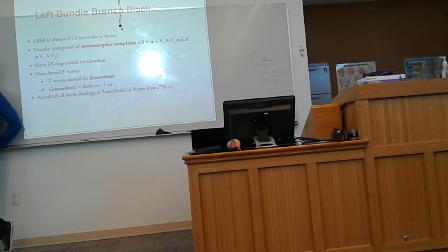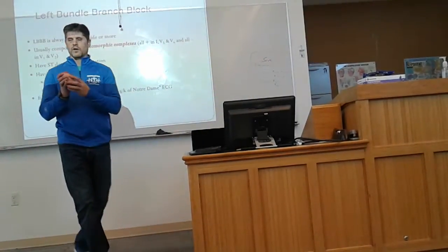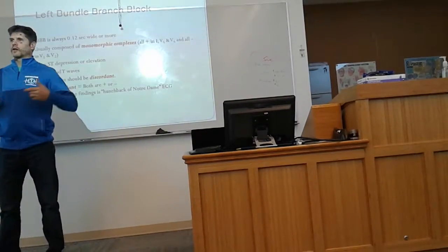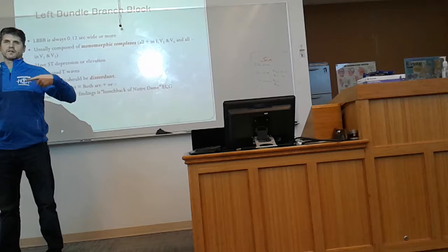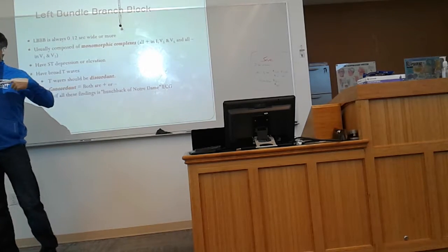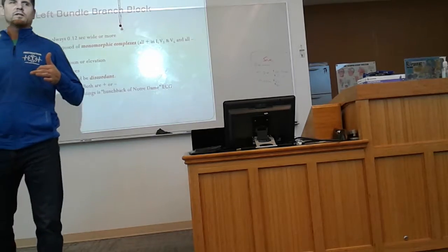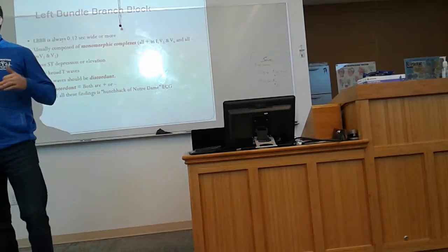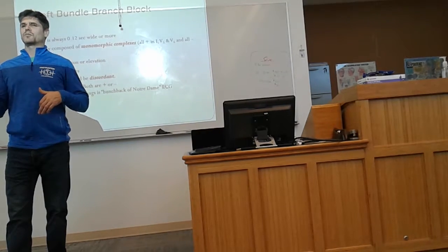Does what he was trying to explain make sense? No. It doesn't make sense to you? No, you thought it in a roundabout way. Lead 1 and V6 are right here, looking at the side of the heart. We have a left bundle branch block, so the majority of the electrical activity is happening on what side of the heart? On the left side. How is the left side depolarizing right now?